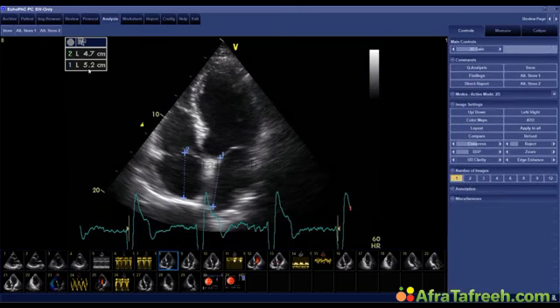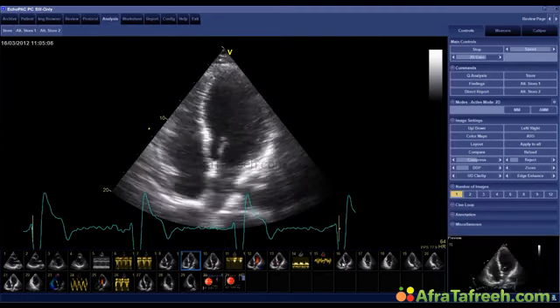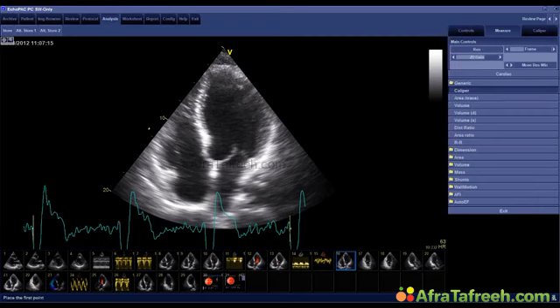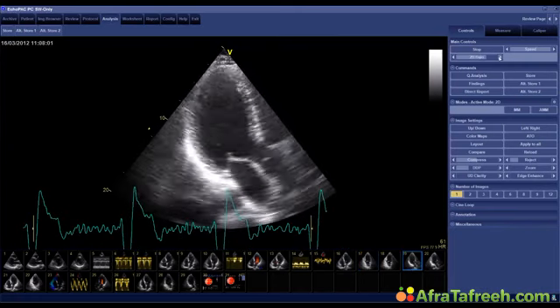What we performed here are some measurements showing the size of the atria, which are basically normal. This is again another 4-chamber view. We performed measurements of the size, just a very brief measurement here, 53 millimeters, which is actually normal size for this patient. He had a body surface area somewhere in the range of 2.2. He was very athletic and participated in a lot of sports. And this is the short axis view here, and this is the apical long axis view.